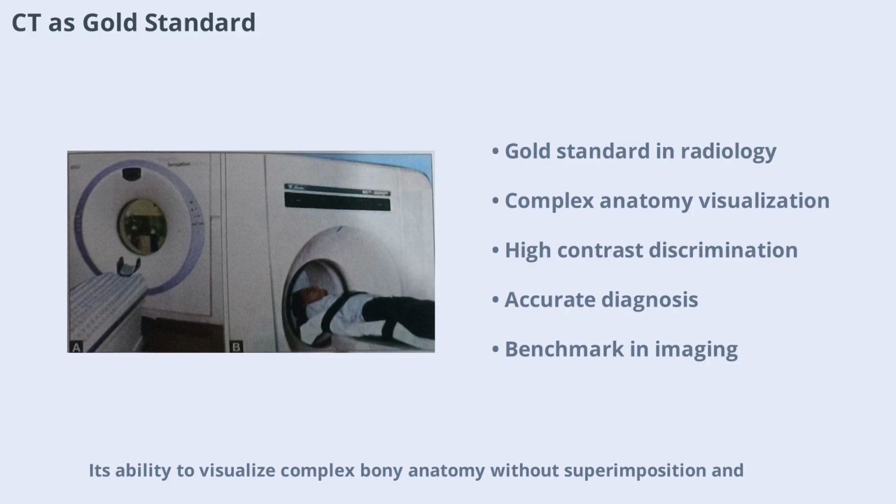Computed tomographic scanning is widely regarded as the gold standard in diagnostic radiology. Its ability to visualize complex bony anatomy without superimposition and provide high-contrast discrimination of soft tissues has revolutionized medical imaging. CT scans are invaluable for diagnosing a wide range of conditions, from trauma to oncology, and their accuracy and reliability have set a new benchmark in radiology.